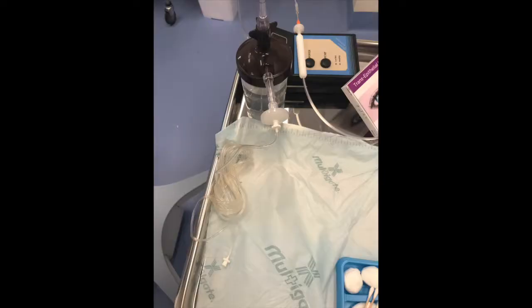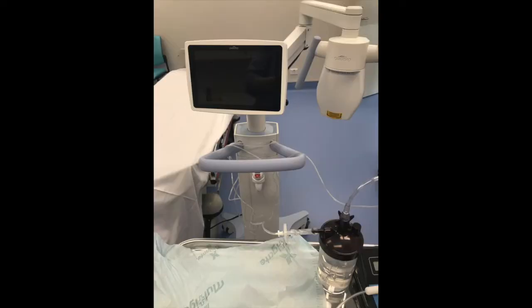There's a really important tip here: you'll see that our oxygen tubing is draped over the Avedro machine, and also that the oxygen humidifier — the bubble humidifier — is sitting on our trolley there, very visible to the person doing the procedure. The oxygen flow on the machine needs to be around one and a half to two liters per minute. If it's turned above that, occasionally the filter on the humidifier can pop off. You'll hear a little pop if this does happen, but it's really important that you can see that it's there to ensure it's all intact. It's also important to stretch out the tubing so that there are no kinks in it.